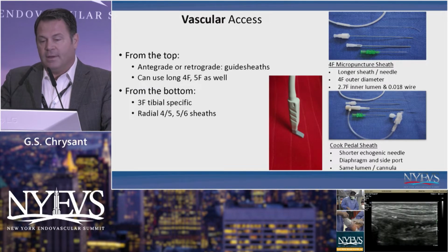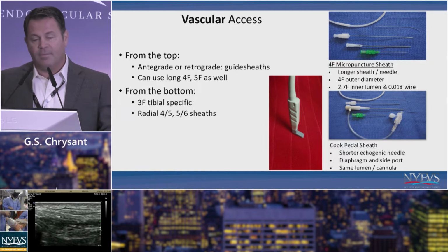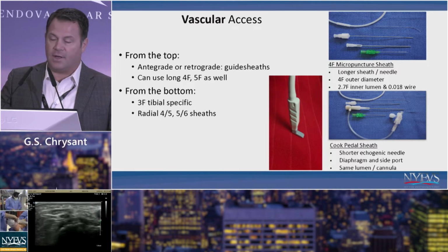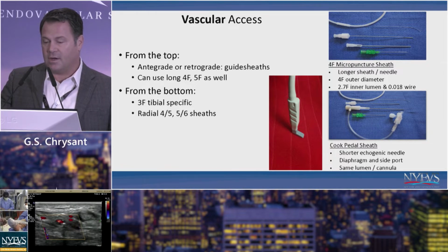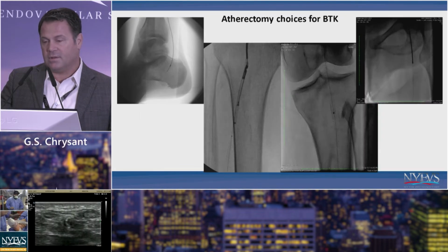In terms of access, you want to have some sheaths that are long that can get you either from contralateral or antegrade. These can come anywhere 4 French, 5 French, 6 French, depending on what kind of equipment you think you're going to need. And then from the bottom, a lot of people will just simply get 3 French access just to gain wire access across the lesion, but some people work through these tibial sheaths as well, and that's always an option depending on the size of vessel. You want to have a good assortment of micropuncture equipment, and I'm obviously biased to the hockey stick probe. I think having good ultrasound is of paramount importance in these cases.